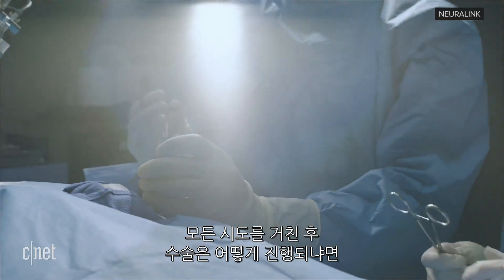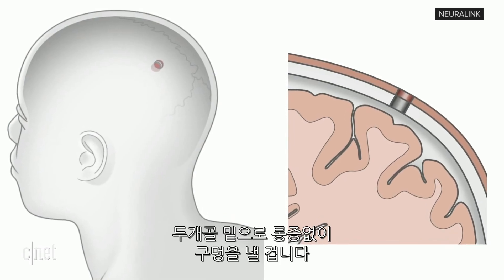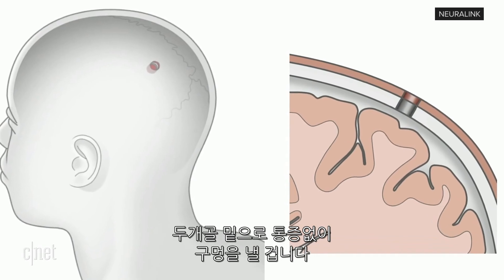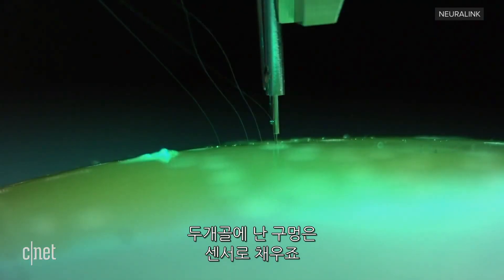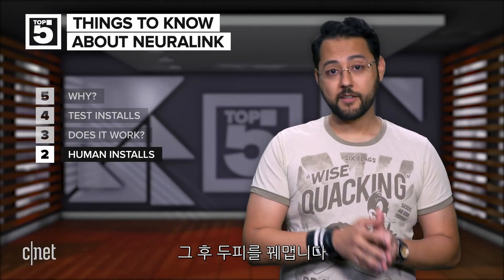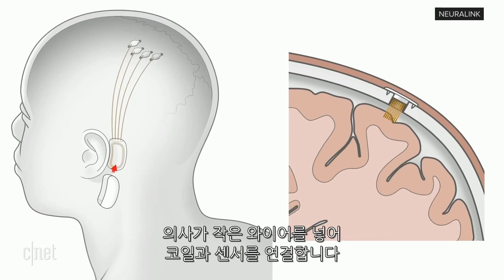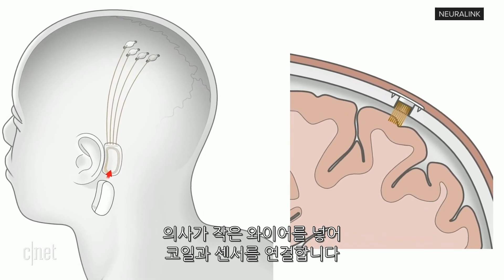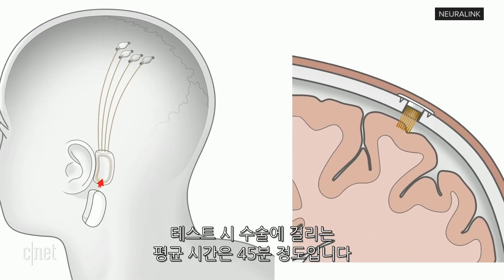Here's how the procedure would go after all the trials: you get a local anesthetic, a small opening is made in the skin, a painless opening is then made in the skull below. After that, there's a quick placement of the implant, then the hole in the skull is filled with the sensor, and the scalp is finally closed up. Then, behind the ear, a small incision is made for a coil, and the surgeons will tunnel tiny wires to connect the coil to the sensors. In tests, total insertion time averaged 45 minutes.